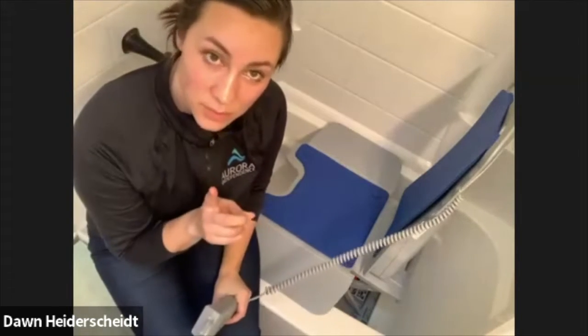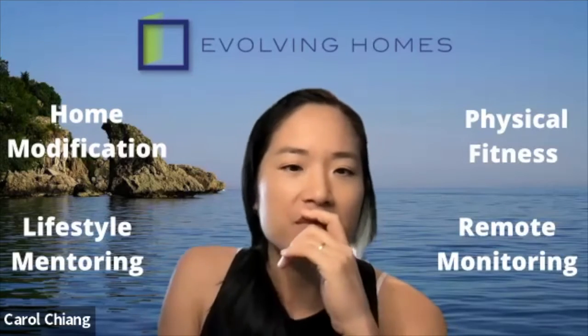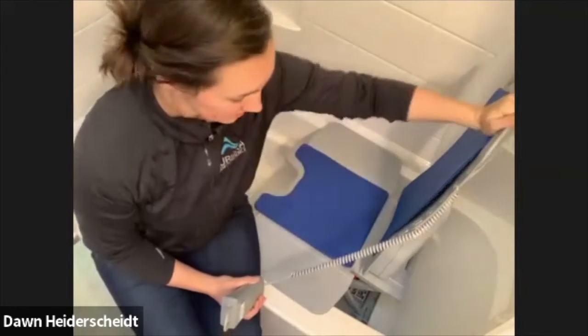The number one thing is you cannot take it apart unless it is in the lowest position. And that has to do with the reclining feature — the connections in the seat need to be all the way up and all the way down. That's the safety requirement.